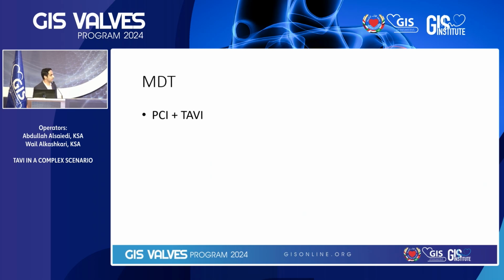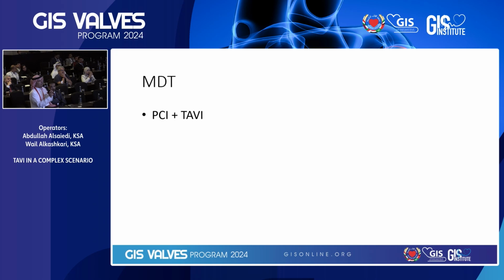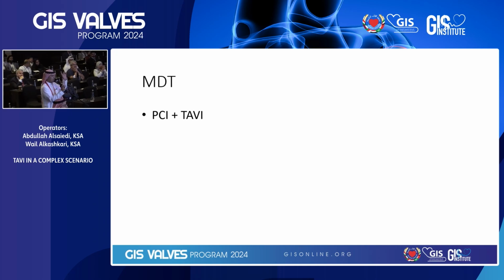So, Dr. Muhammad, the membranous septum, which we did not mention, was about 4 millimeters only. Usually the membranous septum in females is short because by default the heart is small in size but big in capacity. Dr. Muhammad, your approach, please. Approach to what? To the septum or to the patient? Seriously. To the extensive coronary artery disease. Show us the angio again, please.